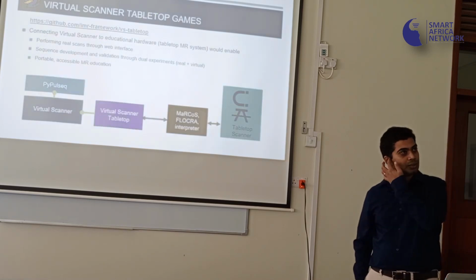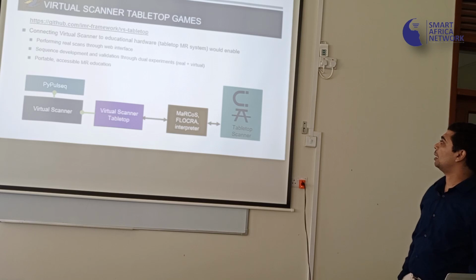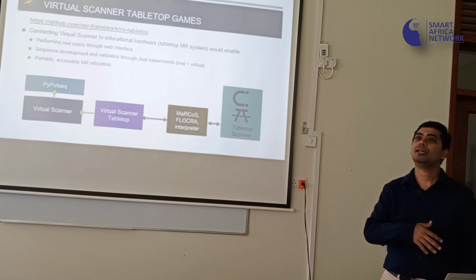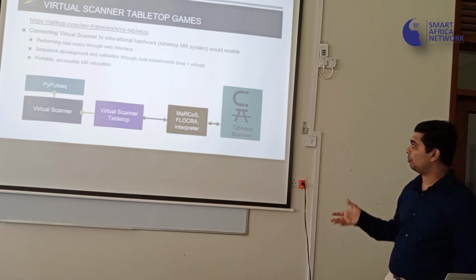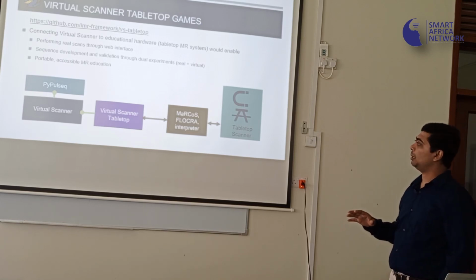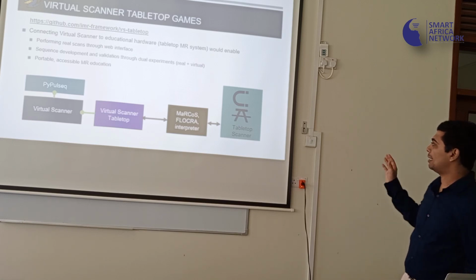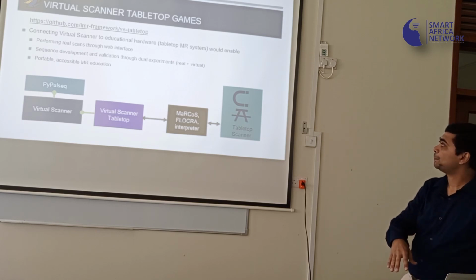Finally, we had a high school student this summer come and help us develop what we are calling the tabletop games. This is a bunch of games to introduce MR to students who never had any kind of brush with MR before. The way we want to make it work is we want to use a Pulseq experience, the virtual scanner ability to actually program a tabletop scanner, which is a little different from what you guys are doing now. But with Pulseq, you could replace the tabletop scanner with the low-field scanner that you have here.